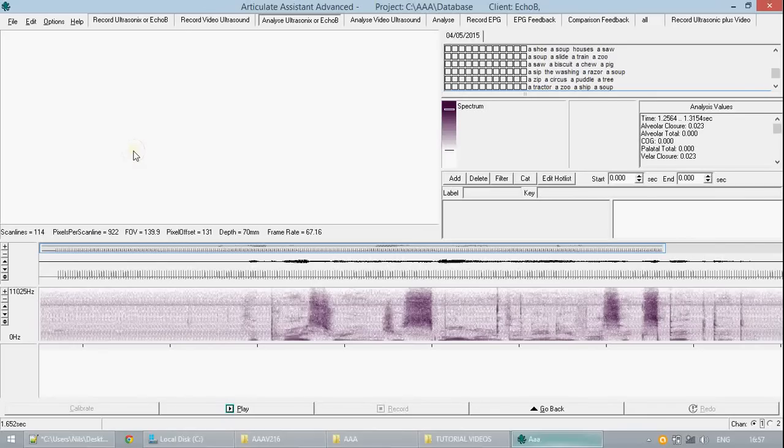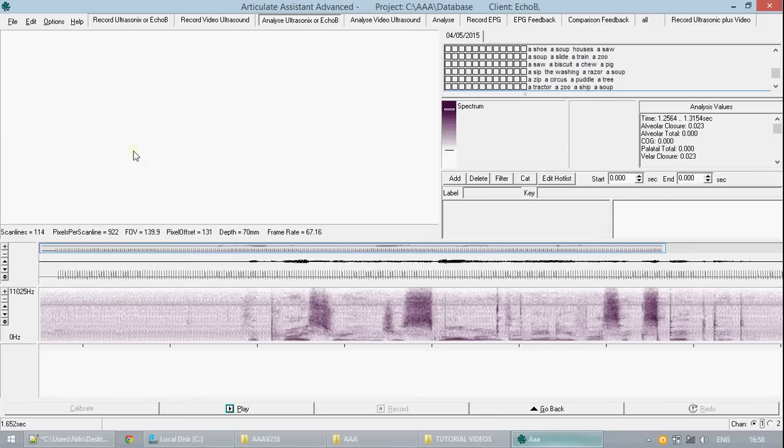Hi and welcome to tutorial 3. Today we will be looking at putting annotations on audio and putting splines on your ultrasonic images.